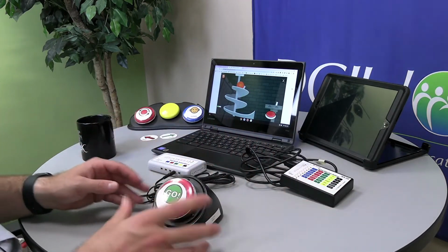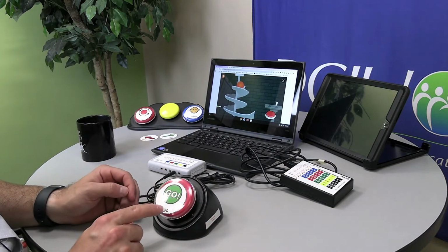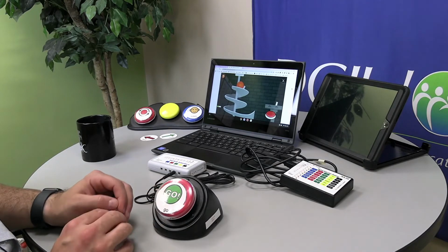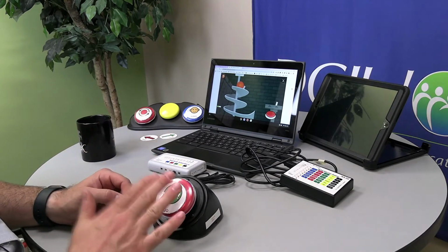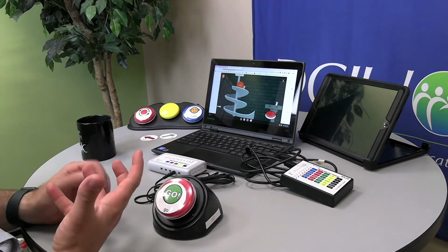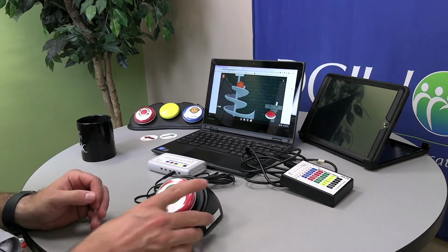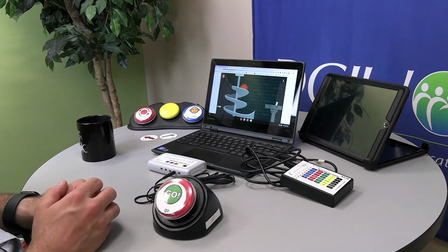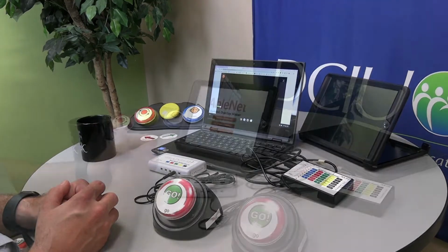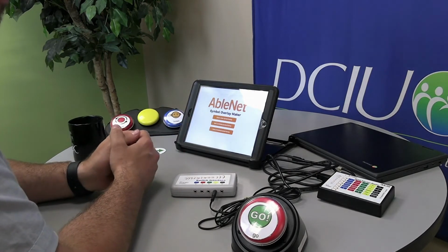And if you'll notice, I've swapped out one more time to include a different device with the core vocabulary word go. So we're focusing on that student learning. When I say go, when I press go, it will activate and the marble will go. So just a nice, fun way to incorporate that core vocabulary in another context. So let's go ahead without further ado. There you go.